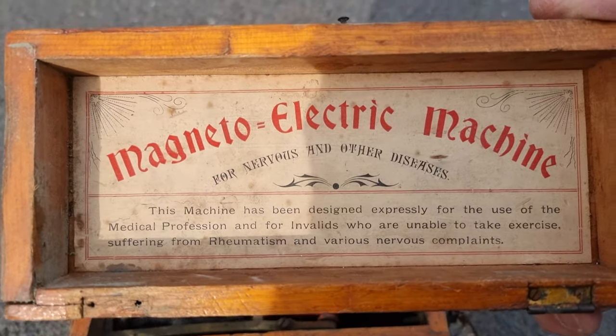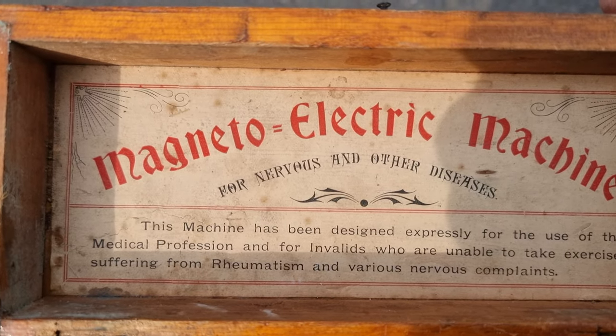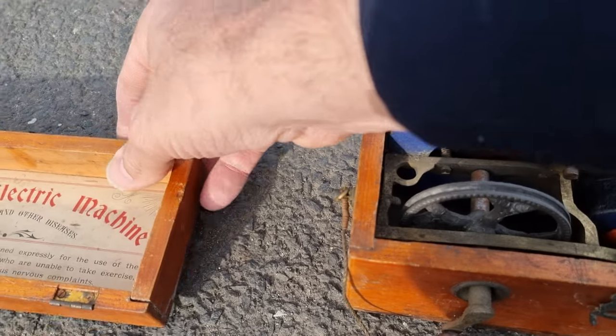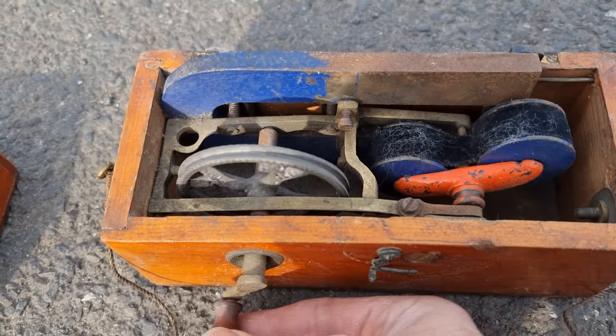This machine has been designed expressly for the use of the medical profession and for invalids who are unable to exercise, suffering from rheumatism and various nervous complaints. And inside we have a wheel that's attached to the crank handle.